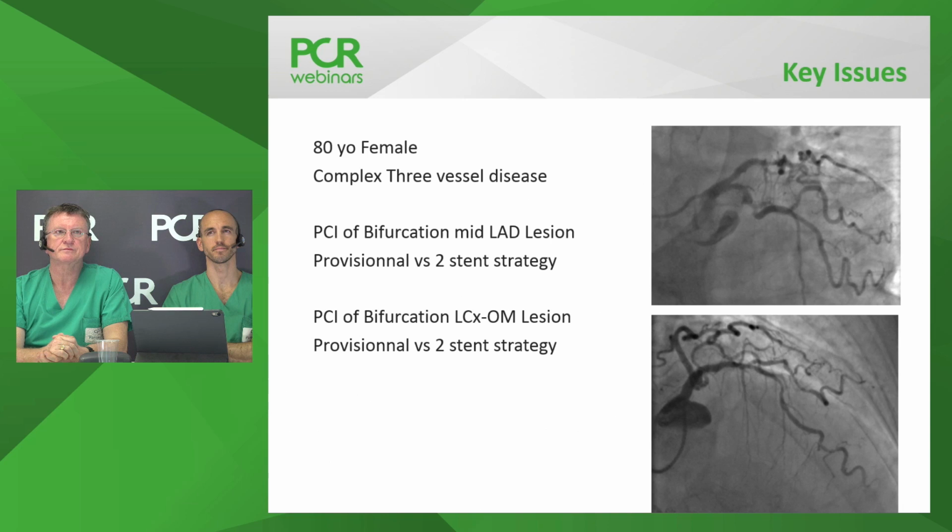To start with the most complex lesion, that is the left circumflex marginal lesion, John, and if you agree, we start with this one and then move to the LAD lesion. So about the setup of this patient, can you show the... Okay, so we can show you the table now.